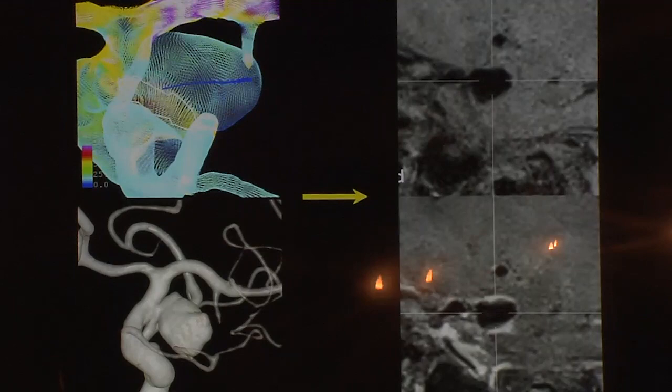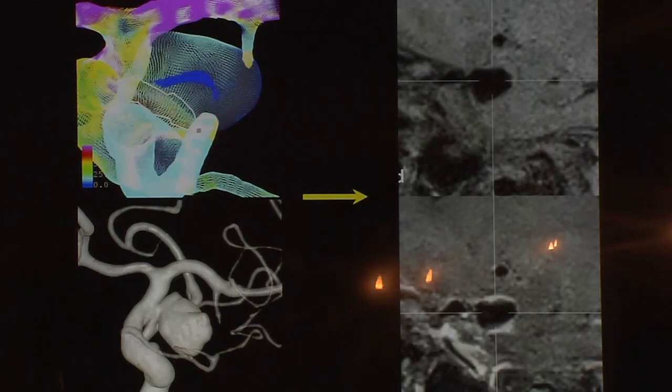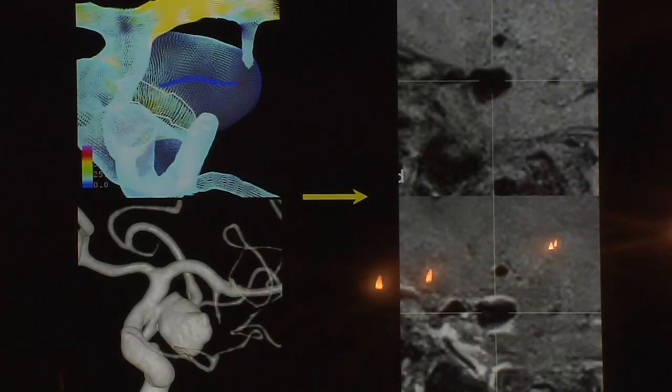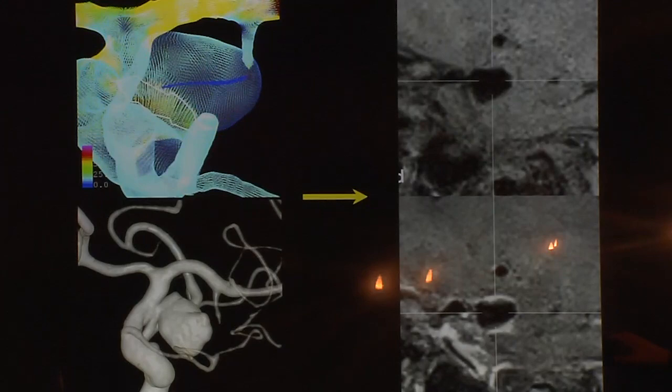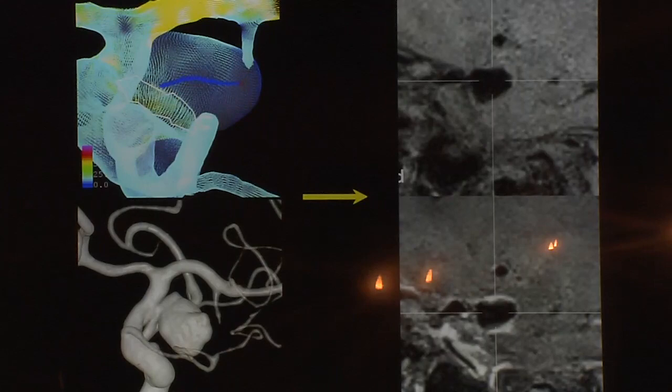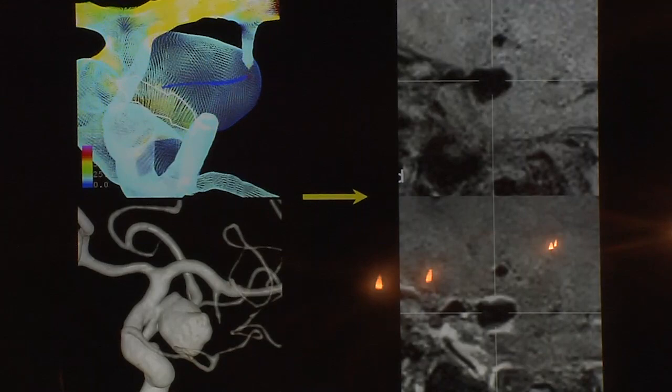In another case — a supraclinoid aneurysm at risk for rupture — with T1 pre and T1 post, we see different vectors working in aneurysm enlargement. Most of the inflammation is probably happening in the anterior or superior wall of the aneurysm. We wonder if this will change over time and make the aneurysm more prone to rupture.